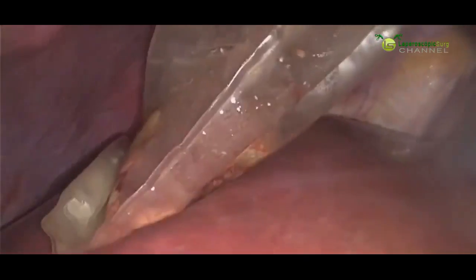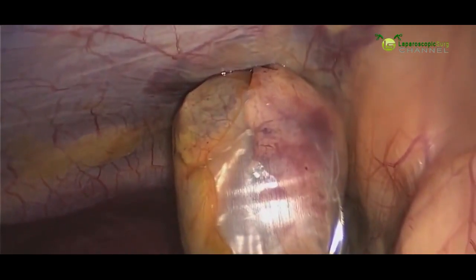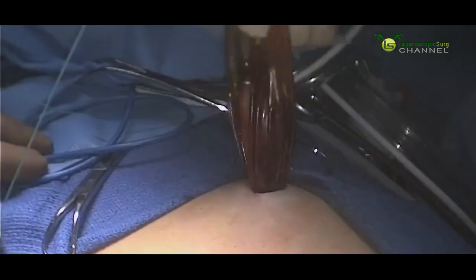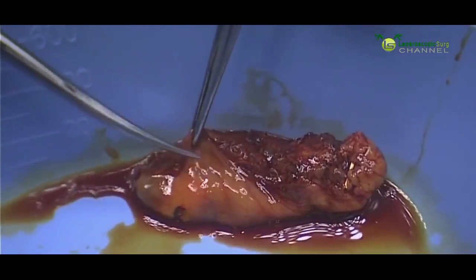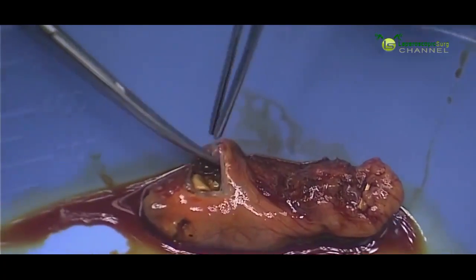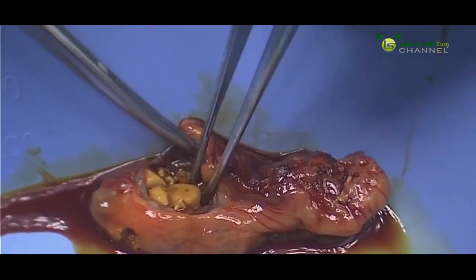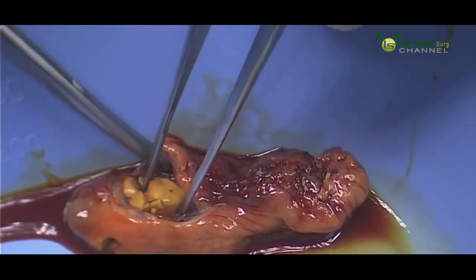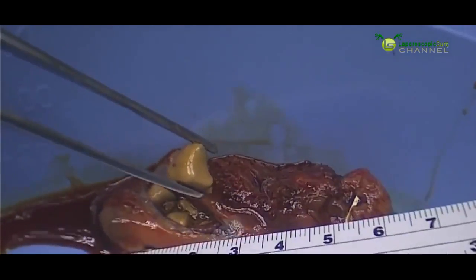We're going to grab this string that's attached to our bag and pull the gallbladder out through this upper incision. And there it is. We're going to cut this gallbladder open so we can see what these stones look like inside. You can see some golden looking stones there — that stone is about one centimeter, or just shy of half an inch.